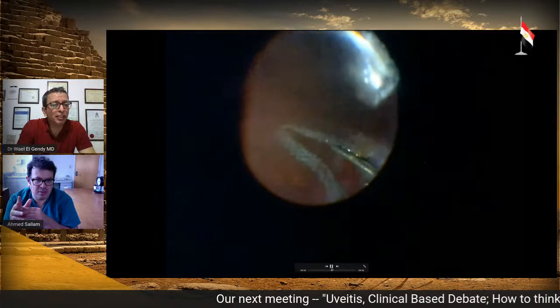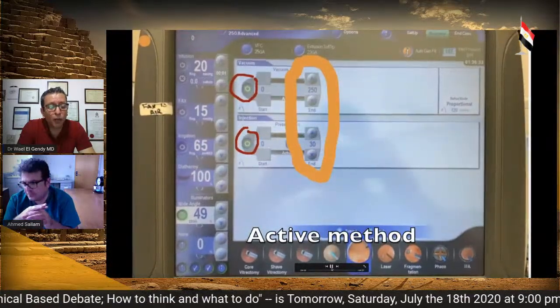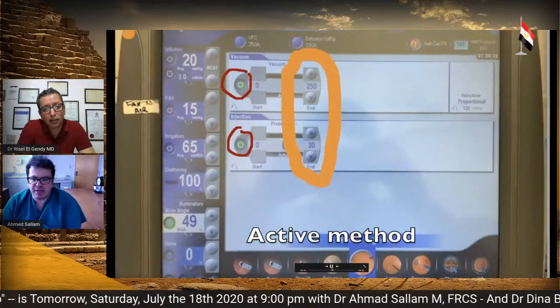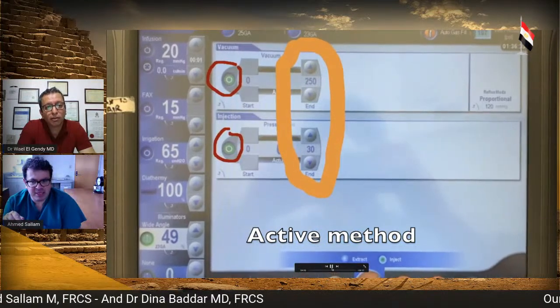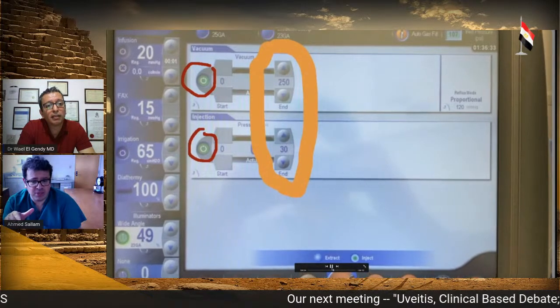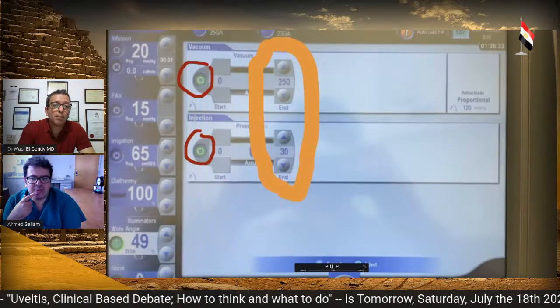I actually stop injecting, and I consider the pressure is enough. I stop injecting, and I wait, and it will come out. Yeah, that's actually even a better trick. So stop injecting. You remember the backflush never in oil, never in oil, and stay still. And then if it doesn't come, it will come. If it doesn't come, then just press a little bit. Exactly. So that's even a better way of saying it.